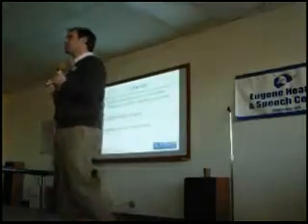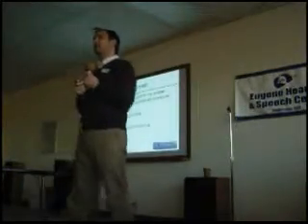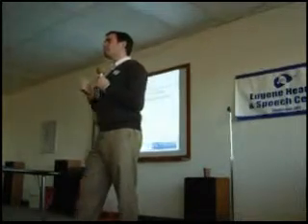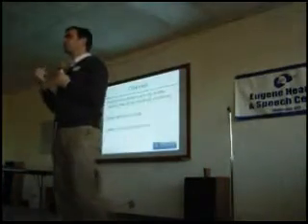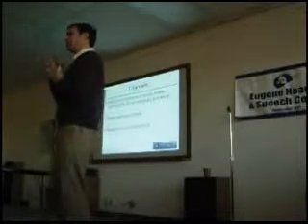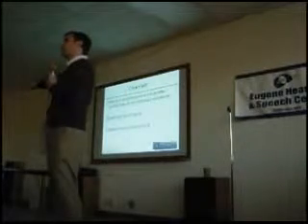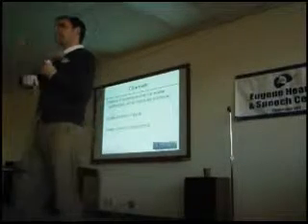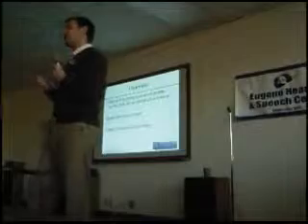With newer hearing aids, you'll get that. You'll get this number thrown at you. And it's a number that's really easy for you to grasp. You'll say, this hearing aid has 4 channels. This hearing aid has 8 channels. This one has 20 channels. That must mean the 20-channel hearing aid is better than the 8, is better than the 4, right? Because it's a higher number.